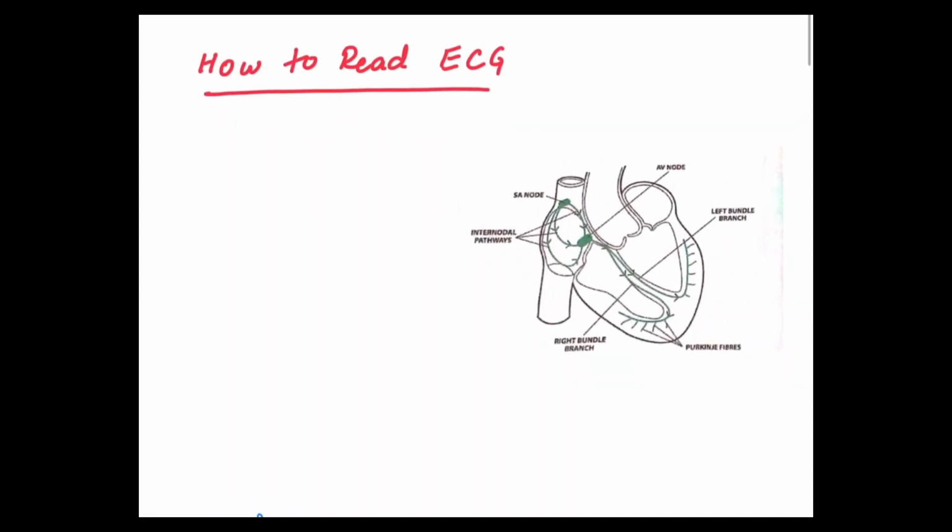Mustafa, and today we are going to talk about ECG, which can be a really confusing topic. But trust me, if you pay your full attention and try to grasp this idea, I will assure you that you will be able to get most of the abnormalities, and you can definitely pick out what's wrong, and you can escalate that to your seniors to save lives eventually. So let's have a look into it.